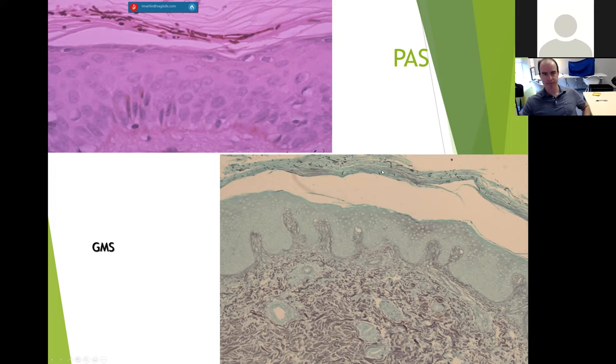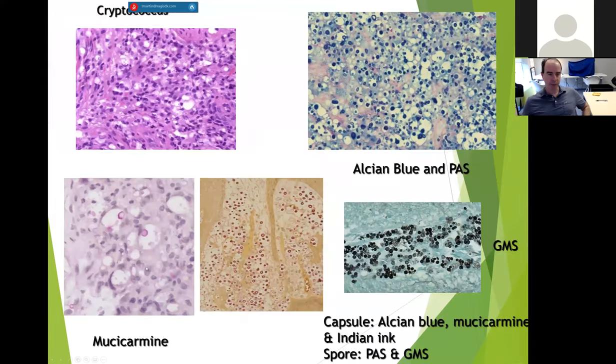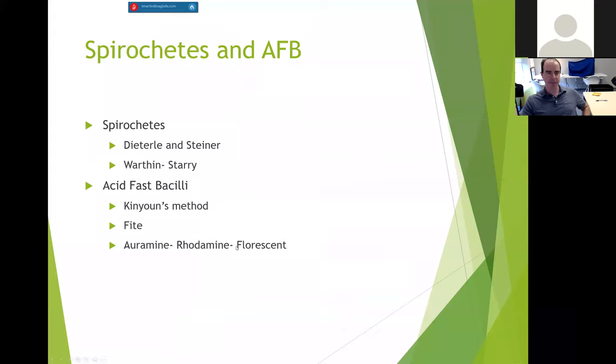Here's crypto with mucicarmine. Here's crypto with Alcian blue and PAS. So basically you're doing a PAS stain with an Alcian blue on top of it. You know, people get all fancy with these. You can do GMS. Here's the GMS and here's the mucicarmine. So there's all sorts of ways you can bring these out.